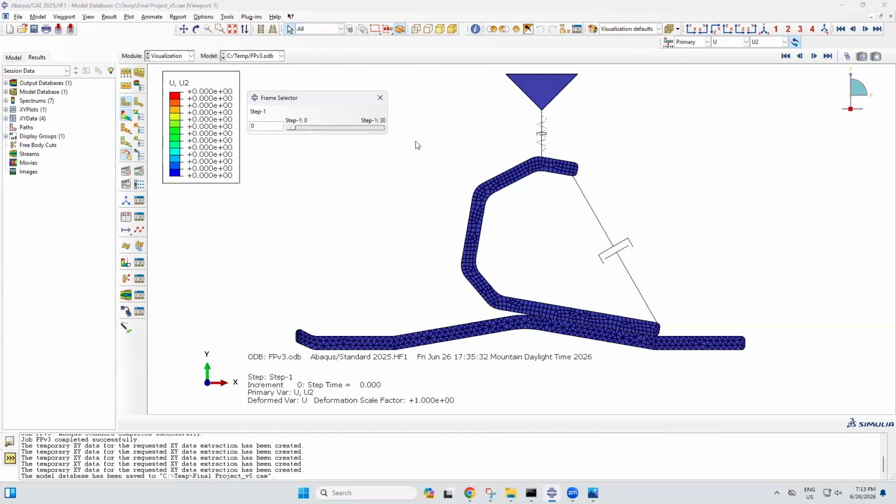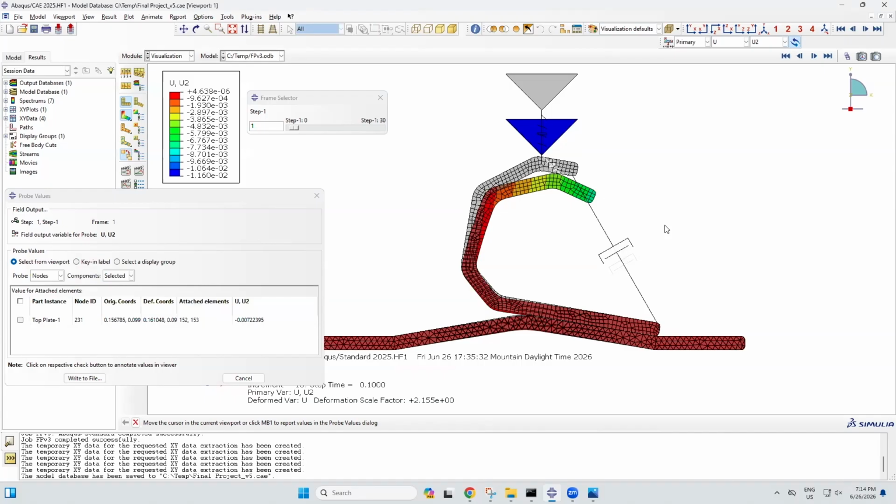Here we can go through the steps of the animation, and we can see the vertical displacements of every single part. Here with step 1, we can see we have a displacement of approximately 7 millimeters downward. Additionally, we see a horizontal displacement of approximately 4 millimeters to the right in step 1.